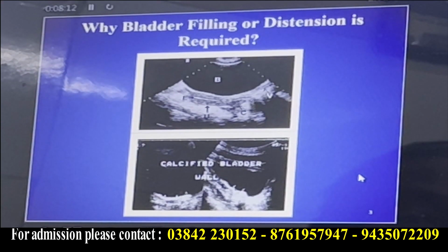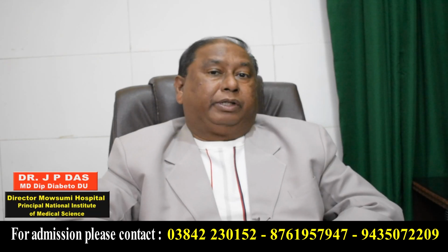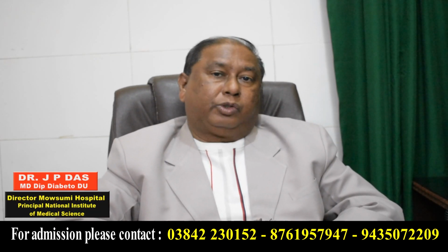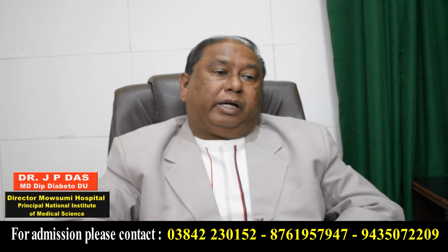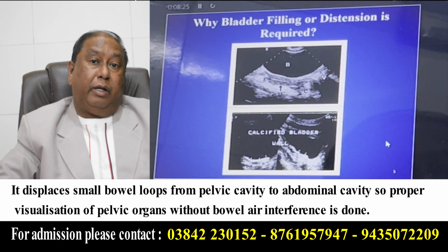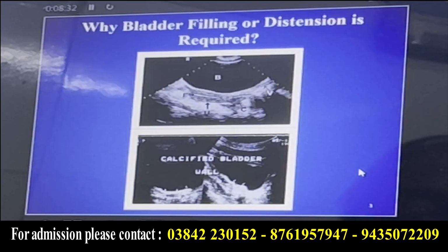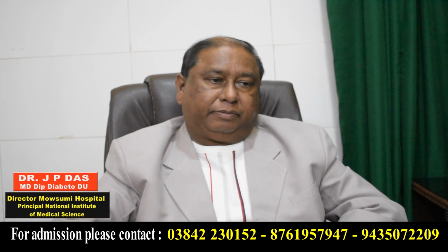And bladder distension is also important for some other reasons. It displaces the small bowel loops, so they will not come in between, from the pelvic cavity to the abdominal cavity. So proper visualization of the pelvic organs without distending the urinary bladder is not possible.